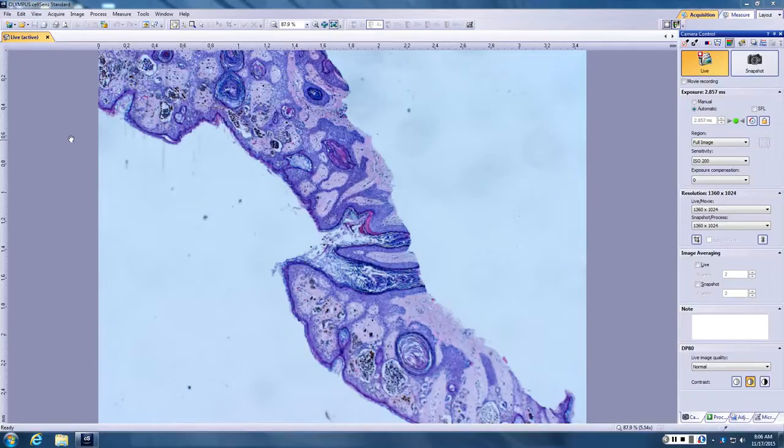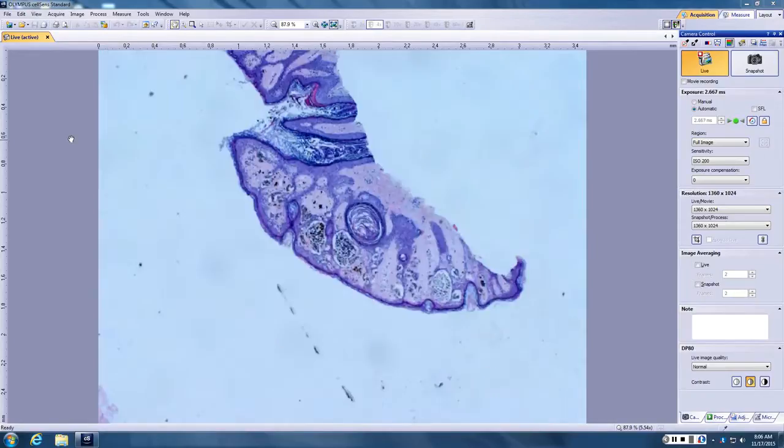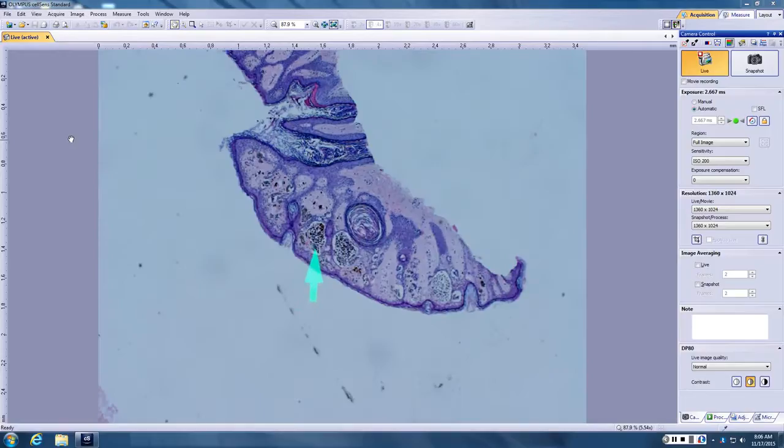It looks very stubby, just because of the horn pseudocysts. So it looks very sebby. But I'm trying to figure out what the pigment is. Yeah, probably melanin with nests. So lesson 1 is the presence of horn cysts when you look with the dermatoscope does not make something a seb. It doesn't rule out anything melanocytic. Horn cysts are very common in melanocytic lesions. People used to take liquid nitrogen and lightly frost it, and you can see the horn cysts. Doesn't mean it's not melanocytic. So that's lesson 1. Okay, lesson 2. What is it?